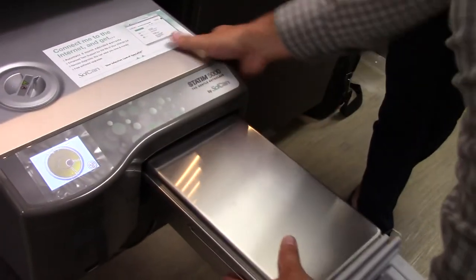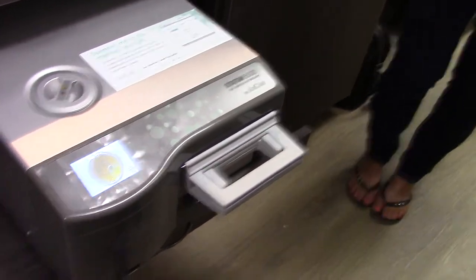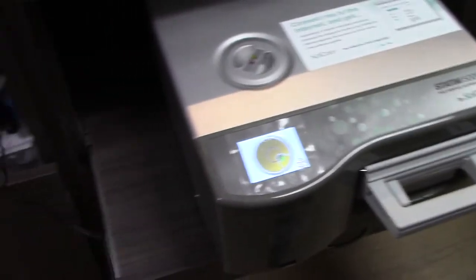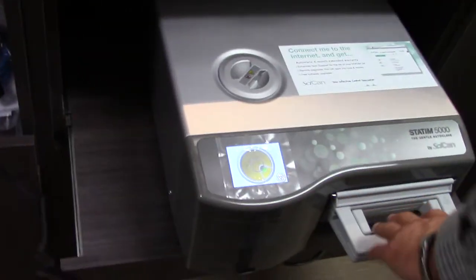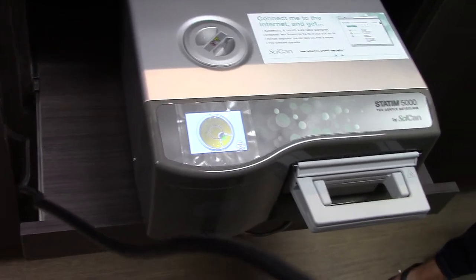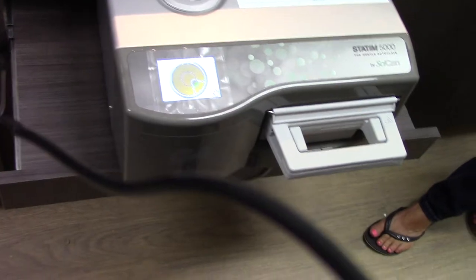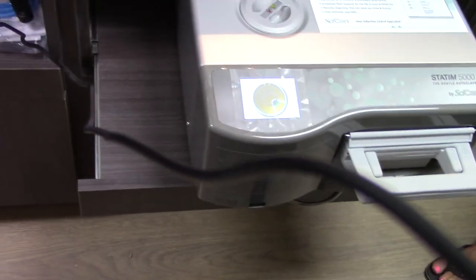So are these, what they have now, so they're going to be dry when they come out as well? No. So the way this works is you'll go through the sterilization time. Let's say it's the 9-minute cycle. So it goes to the 9 minutes. After it's done, you can pull it out right away. After the cycle, though, it'll run a dry cycle for 60 minutes. The reason is because sometimes you're not here to pull it out, so the load won't be sitting wet.